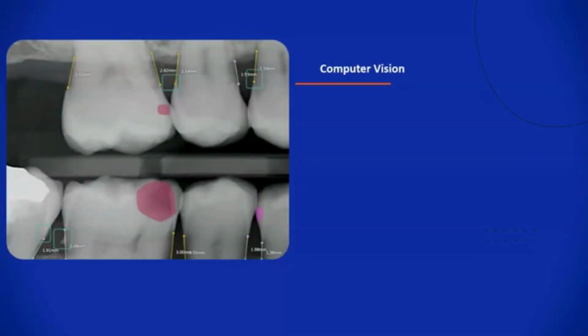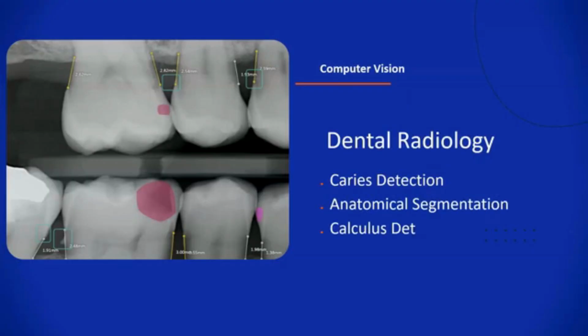The radiology, I want to emphasize that when people look at these radiographic interpreters like Pearl, and they're kind of put off by this, well, I could do that. I mean, I could see the disease there. I could do that. It's not doing anything I can't do. I would agree, because the way these are trained is by showing them hundreds of thousands of images and showing them how they're interpreted by humans, and they learn from our experience. So you could do that, but the computer's faster and it's more accurate.